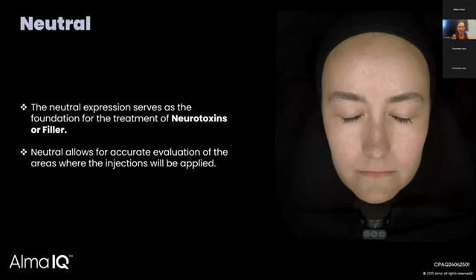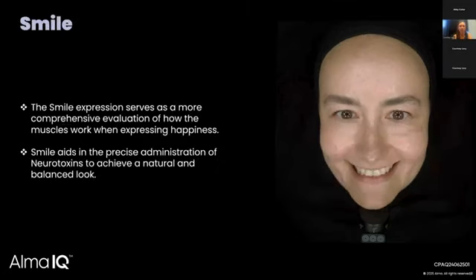And obviously, when we make different facial expressions, we're going to highlight different areas, like the glabella, the forehead, or perioral wrinkles, etc. It's important to point out here that when a patient has a treatment with a neurotoxin and they're laying on the treatment bed, the doctor will ask them to make these facial expressions to guide where to place the neurotoxin. So this isn't taking away from that.